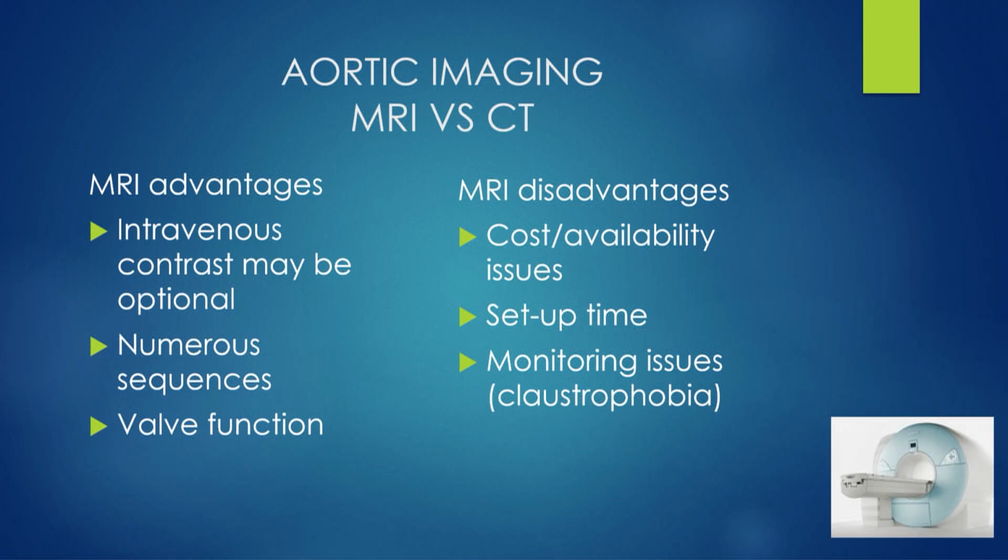All right, so let's talk briefly about some of the other techniques, in particular MRI. The advantage is that contrast is really optional. We don't usually need gadolinium. We may give it, but you don't need contrast.